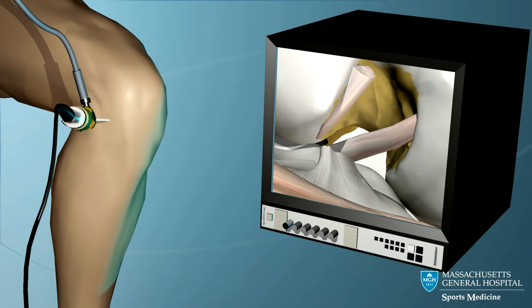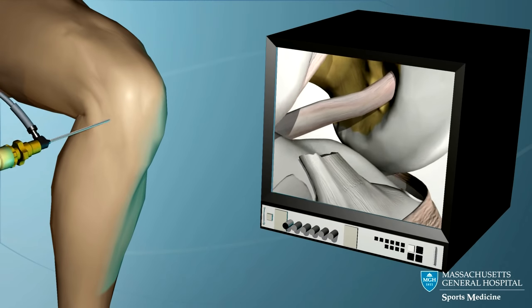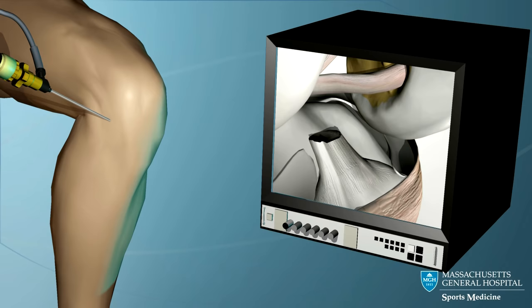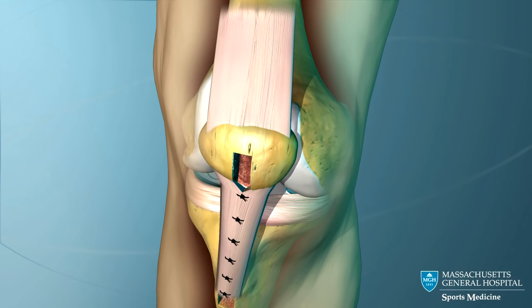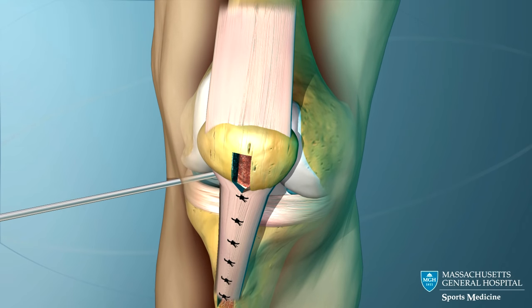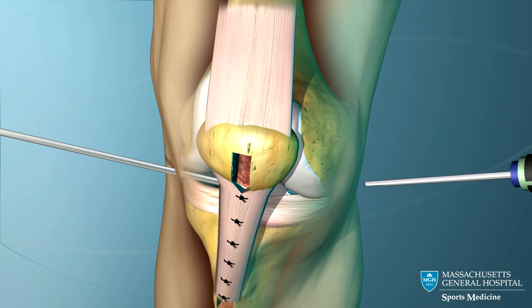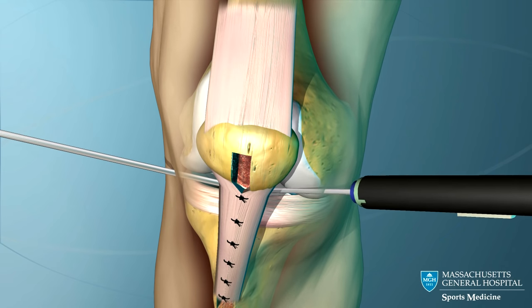The rest of the operation is performed with the aid of the arthroscope while viewing the inside of the knee on a television monitor. The arthroscope is introduced into the knee and the joint is inspected. Any associated problems such as torn cartilage are corrected.